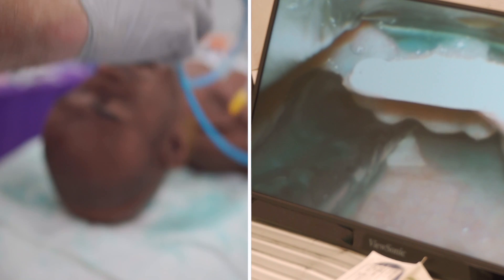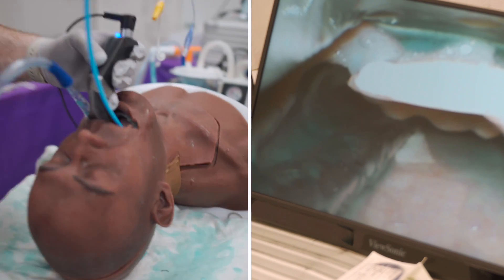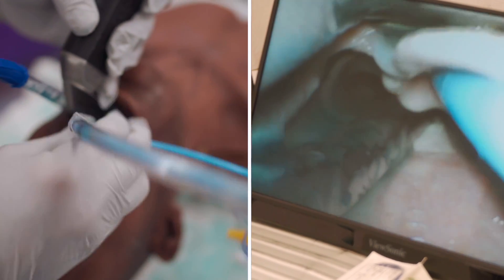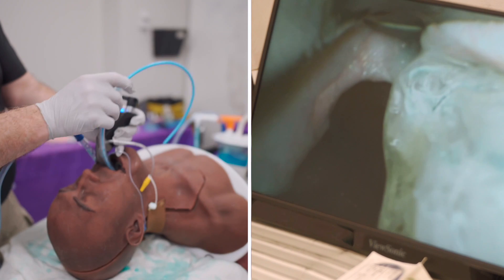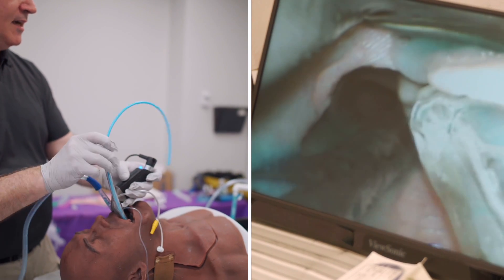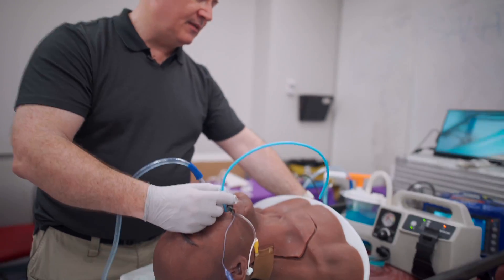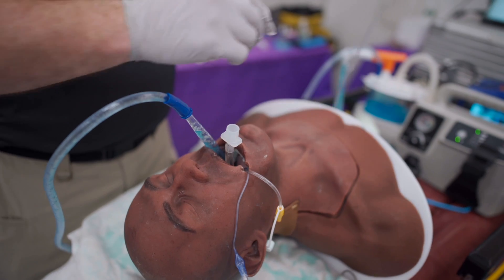I'll now use my pre-loaded bougie in a tracheal tube — the tail of the bougie threaded through the Murphy eye — to come around the base of the tongue and into the airway and into the larynx. I'll turn this a little posteriorly and place it a bit deeper. I'll detach the tail of the bougie from the Murphy eye and begin tracheal tube advancement. As I reach this point, I give it a leftward twist to avoid hang-up on the right corniculate cartilage and place the tracheal tube. I then remove the laryngoscope and the bougie.